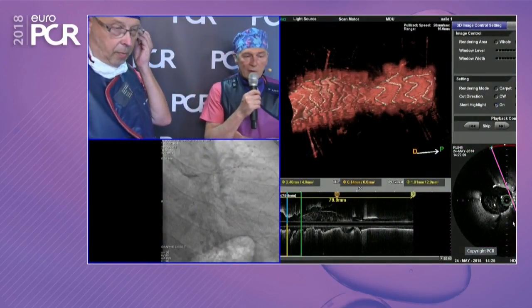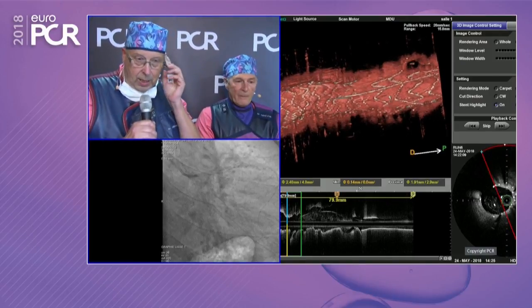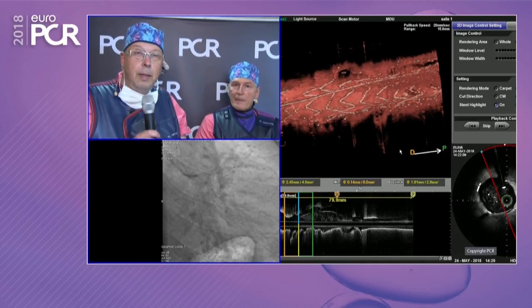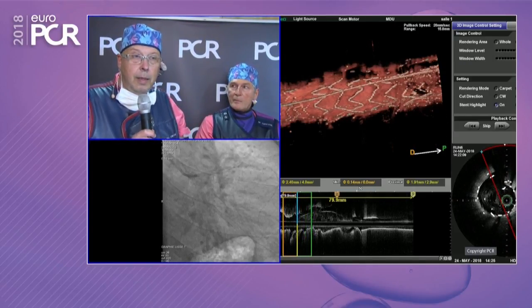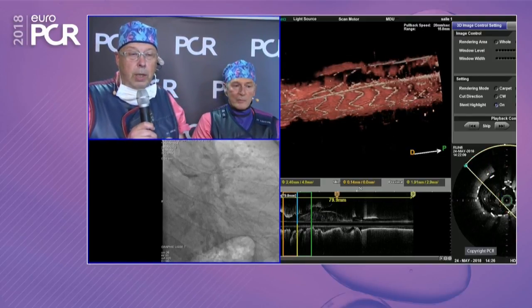So Bernard, very good to have you here now. It's also from the floor: what are your tips and tricks in shaping the wire to make the recrossing easy, when you have to cross?